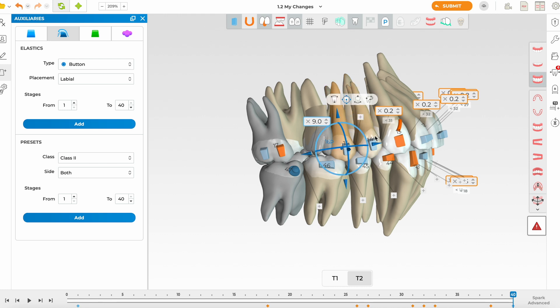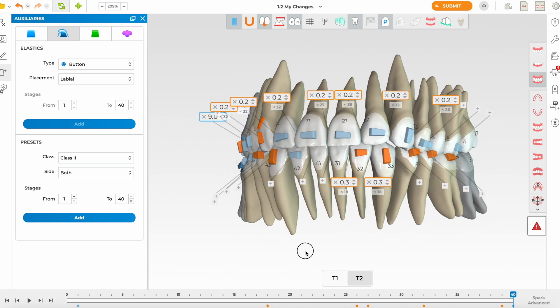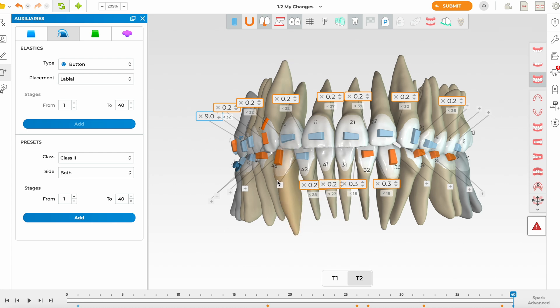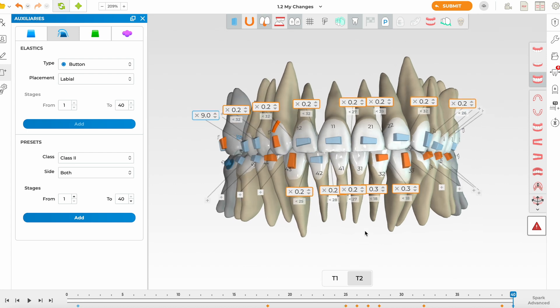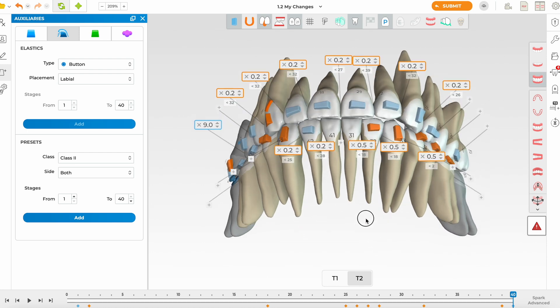I'd like some root uprighting as we distalize. Looking at the lower arch, the patient needs more IPR in the lower — I want to make it more symmetric. The midline is shifting but it was always shifted, so we may do some asymmetric IPR. She has large lateral incisors so we can do a bit more on one side. We can safely avoid IPR on one contact and plan asymmetric IPR — the patient won't notice the slight size difference.